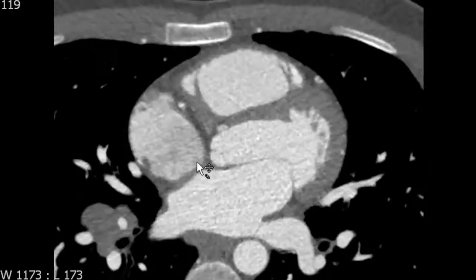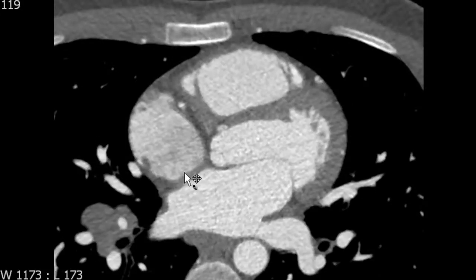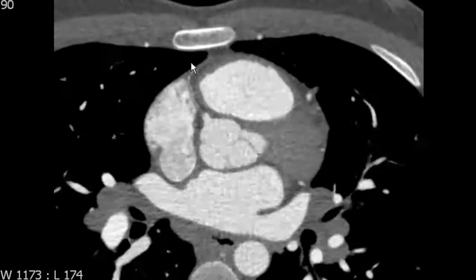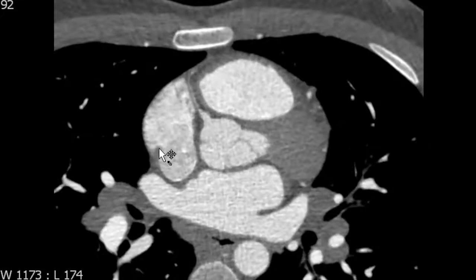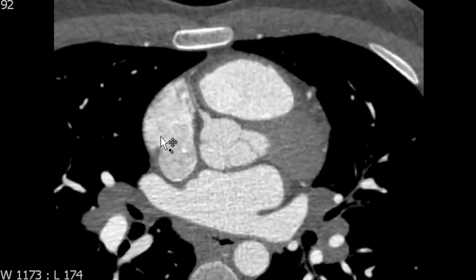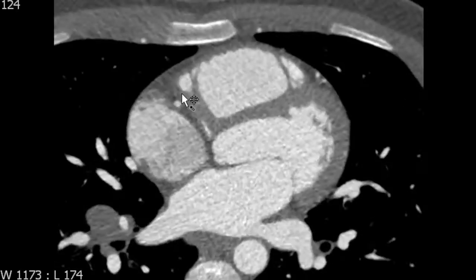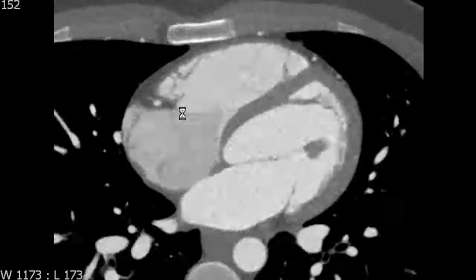There is a second portion of the right atrium that is more posterior and does not have any trabeculations. There is a thin ridge that acts as a landmark separating the smooth portion of the right atrium from the trabeculated portion. The smooth portion of the right atrium is also known as the sinus venosus.